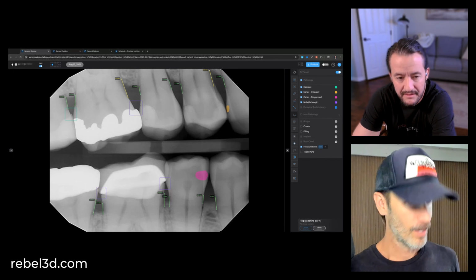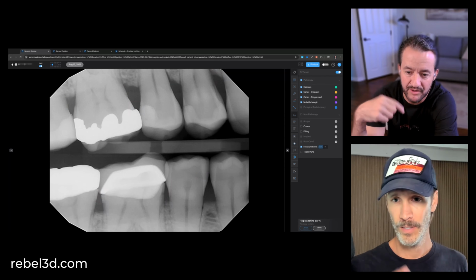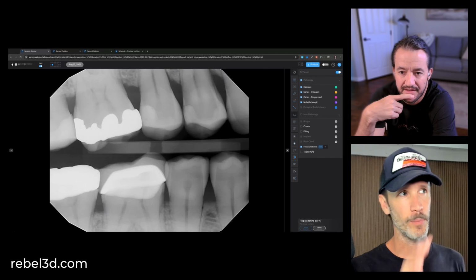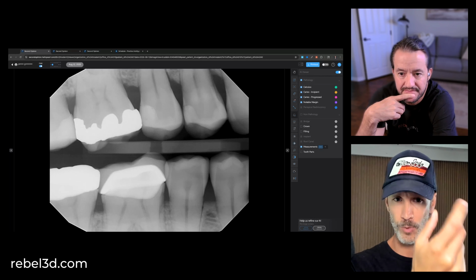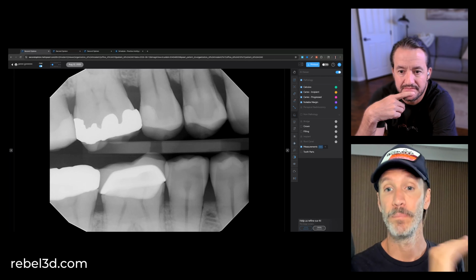Okay. So that's what you measure with the perio probes. Yeah, similar, but this is a radiographic way. The perio probe is what's happening above it, on the actual tissue. This is looking at radiographic bone loss.